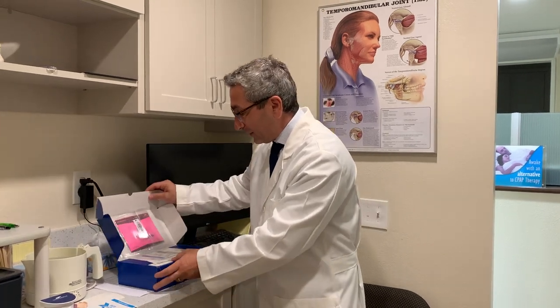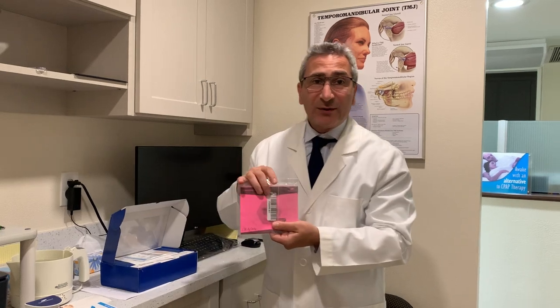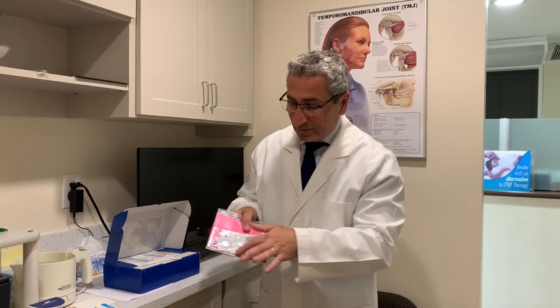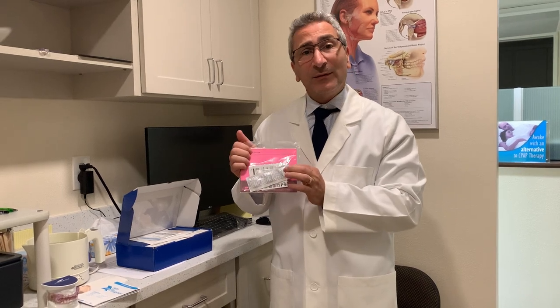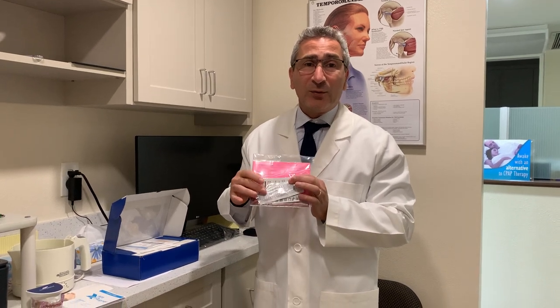As we open the case, there are pink instructions from Somnomed. Read everything — it goes over cleaning, warning, and warranty. Inside the bag there are three cleaning tablets. I recommend using these about once a week to clean your appliance. They are like denture retainer cleaners. When you run out, you can order more online or from Somnomed, or go to CVS or Rite Aid and buy some denture retainer cleaners.